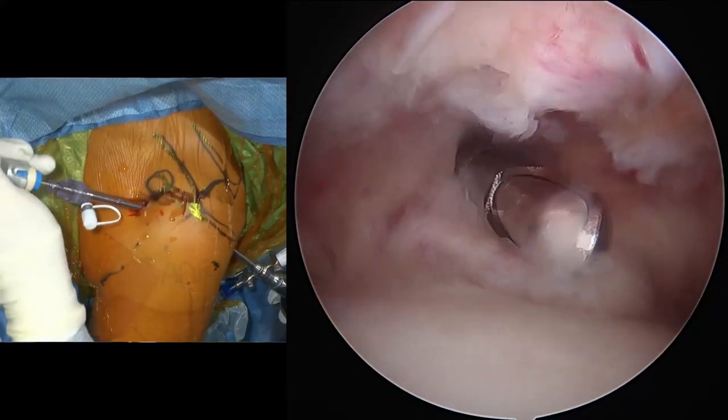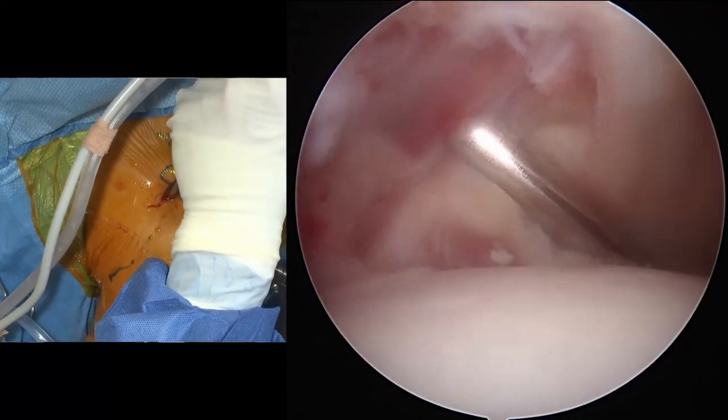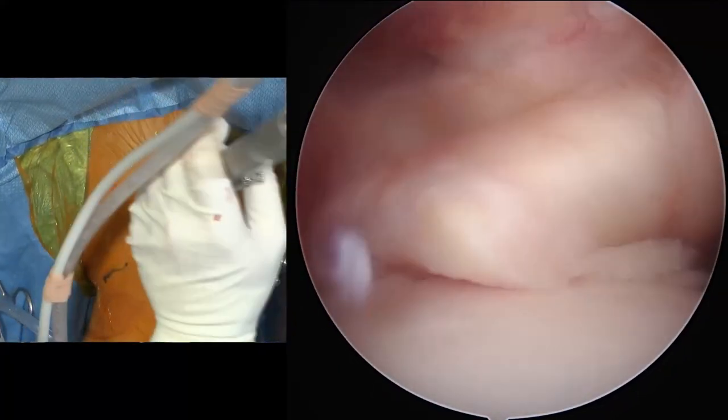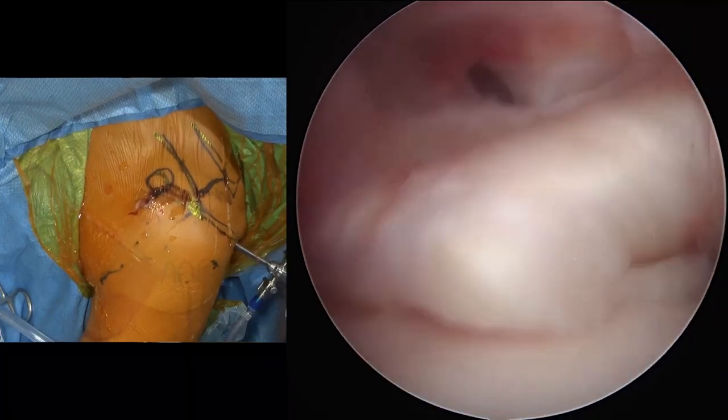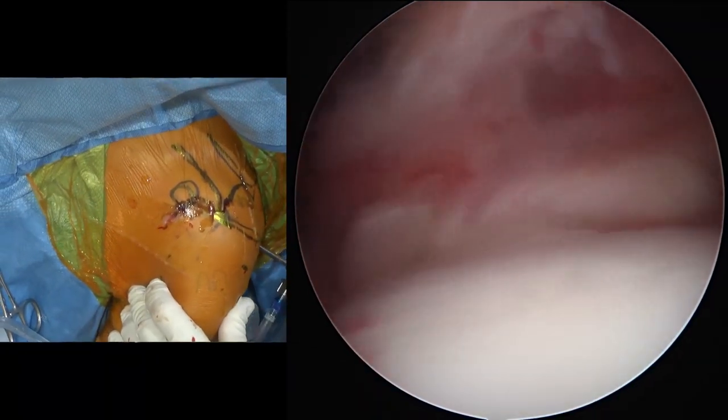So he's got this upper edge. I'm just trying to see if it's just a partial thickness injury. Okay, let's go here, like there. Pull back. It's not clear.